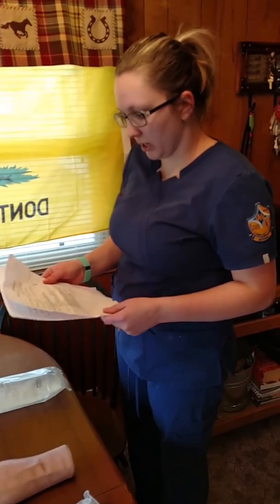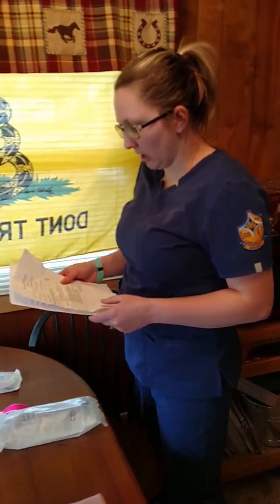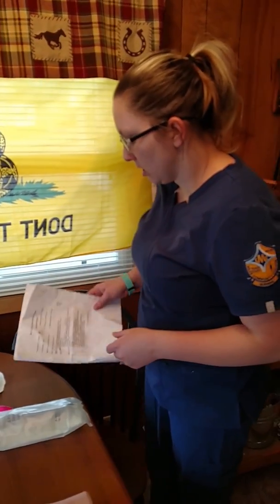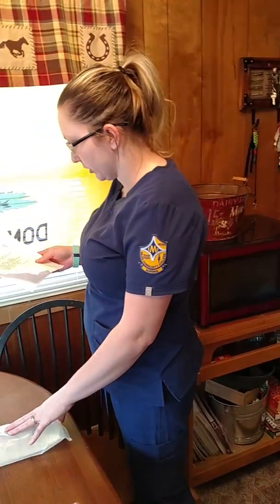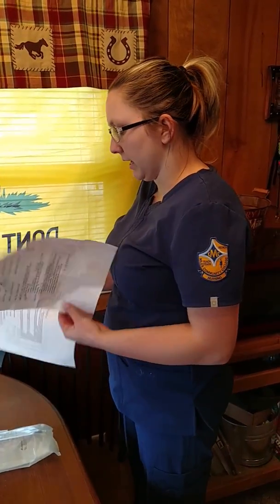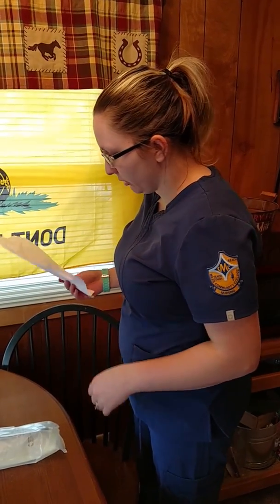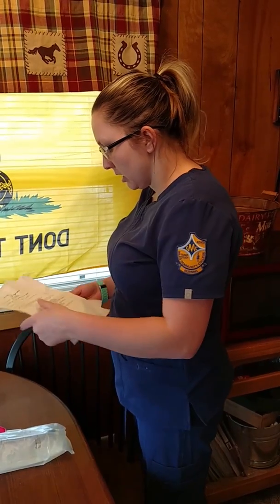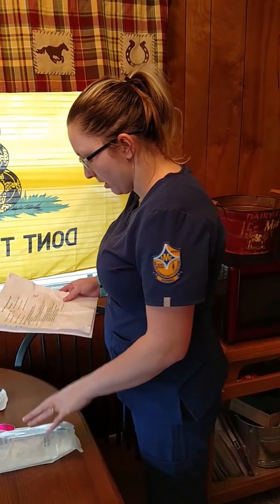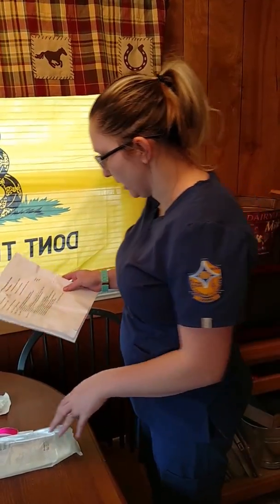So it looks like the doctor has ordered rehydration and antibiotic therapy for IV needed in room 1. So I'm going to go ahead and check the MAR, make sure all the orders look correct. Go ahead and do my 5 rights of right medication, right dose, right time, right route, right patient, right documentation. I've done the math, figured out my drops per minute, so it'll be 28 drops per minute.